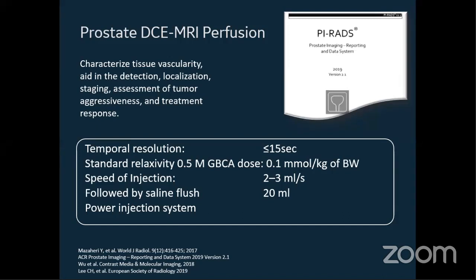But it depends on MRI system capabilities, spatial resolution requirements, and other parameters and preferences, but preferably it should be between 5 and 8 seconds. Why are acquisition times greater than 15 seconds generally not used? Because of the difficulty detecting early enhancement and capillary transit time, which is less than 5 seconds.